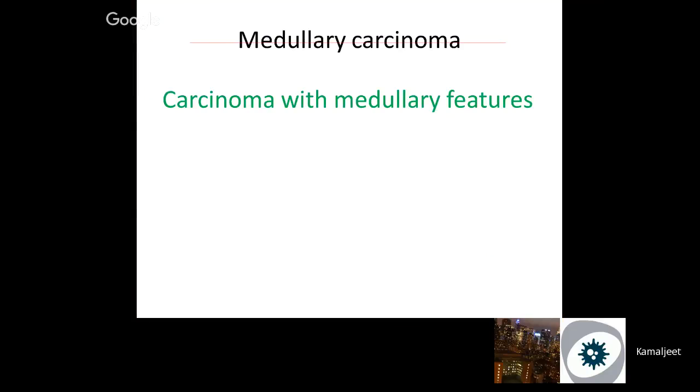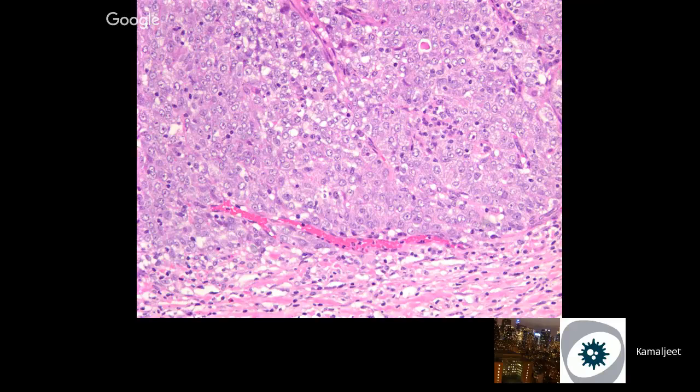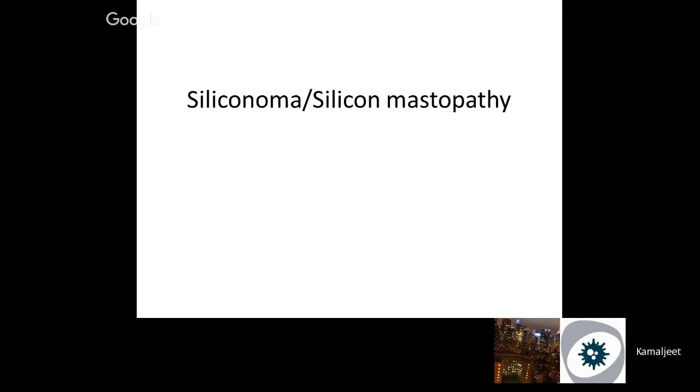Medullary carcinoma is out of fashion. WHO has something called carcinoma with medullary features, and I don't know if they might ask you. This is not medullary. This is something I took a picture of that looks like medullary. So the nuclei are high grade. They look like syncytium. They have prominent nucleoli, pushing border, and there will be tons of lymphoplasmacytic infiltrate. That would make it a classical sort of medullary with triple negative markers.